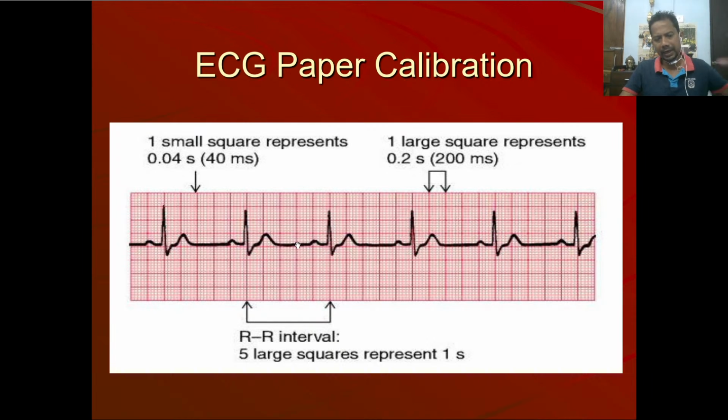So now for aVR, what is happening? SA has fired. Remember that circle again. Impulse is going from the atrium into the ventricle, so it is going away from aVR. aVR is out here, minus 150. It is going like this, so aVR is now not happy. It is saying all the impulses are going away from me. So it gets sad and it draws negative complexes: negative P, negative QRS, and negative T. That is the normal ECG. That is the normal aVR. It is not abnormal.